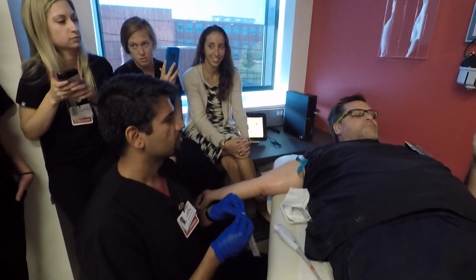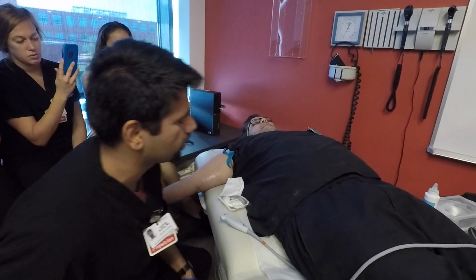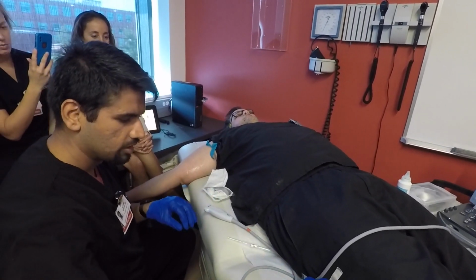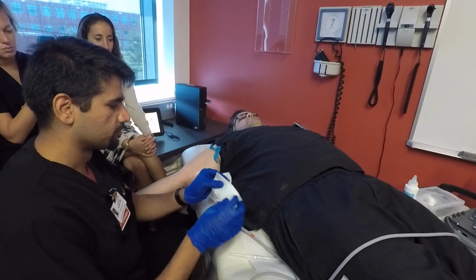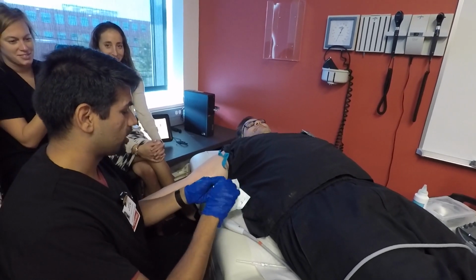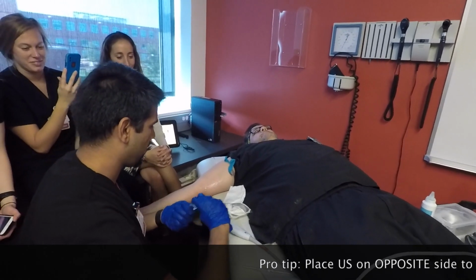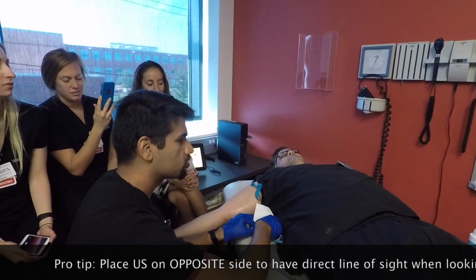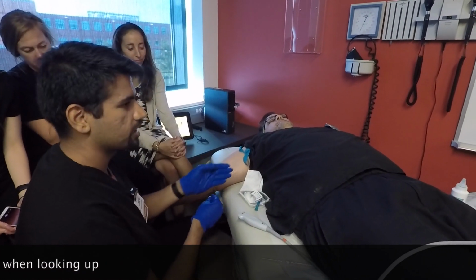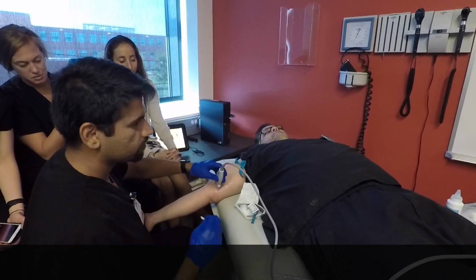Sir, do you think it's a good idea to have the machine on the other side of the patient? 100%. Having direct line of sight to what you're doing and to what the machine is showing you is essential, especially when you're first starting out doing this procedure. And I'll tell you, you've all put this in in hallways, as people are passing by you, and that makes it significantly harder. But to truly do this well, you need to have the ultrasound machine in line of sight. You need to be able to look from here and say, I can see what I'm doing and move at the same time. So we'll look again.